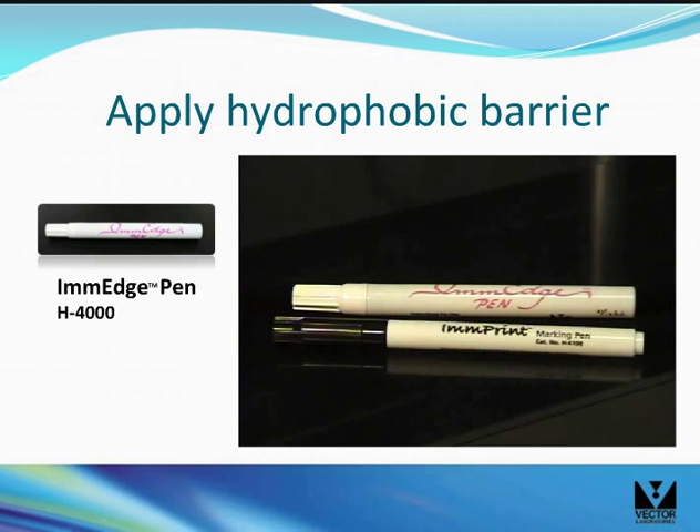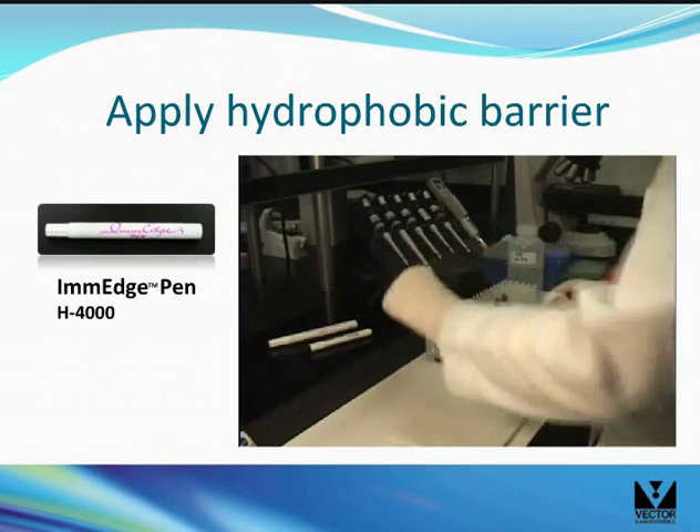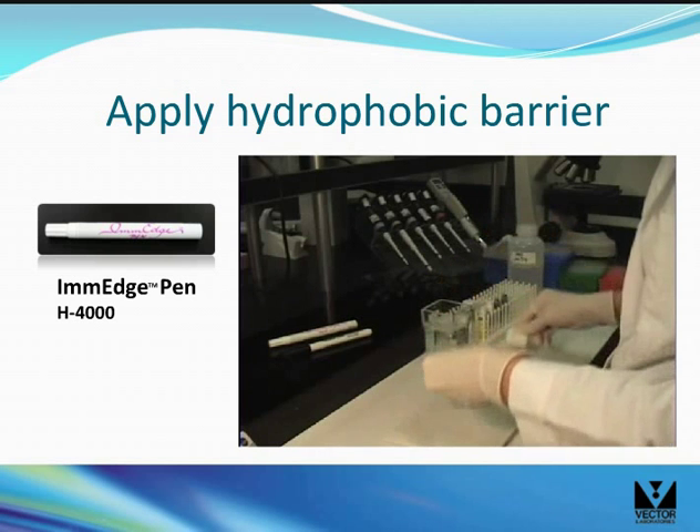If you are using the pen for the first time, give the pen a good shake. Depress the nib into the pen by pressing down on the pen tip on a soft surface like a couple of paper towels. The blue solution will fill the nib and the pen will be ready for use.